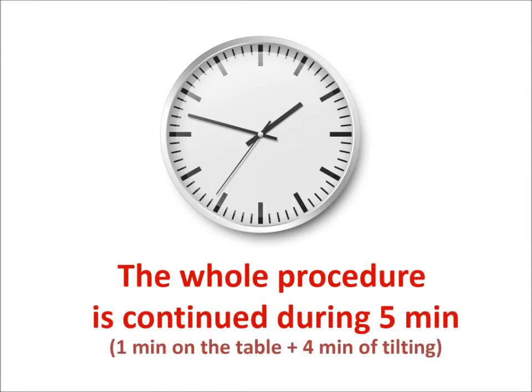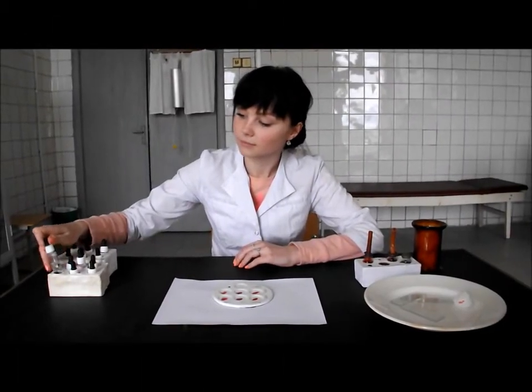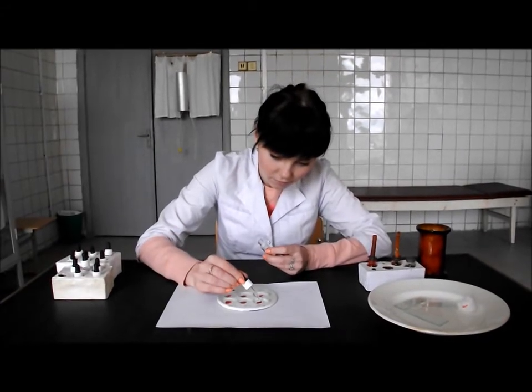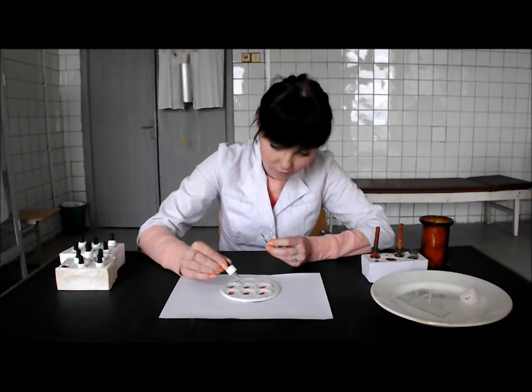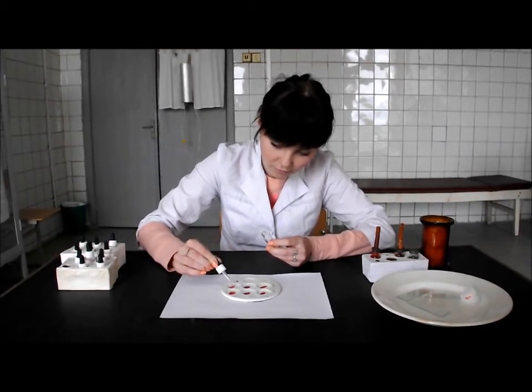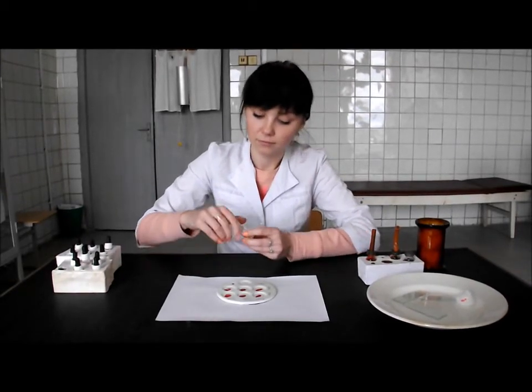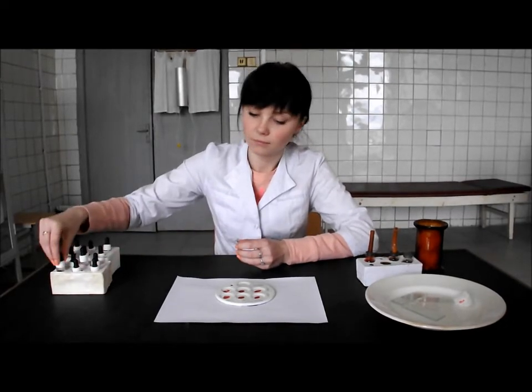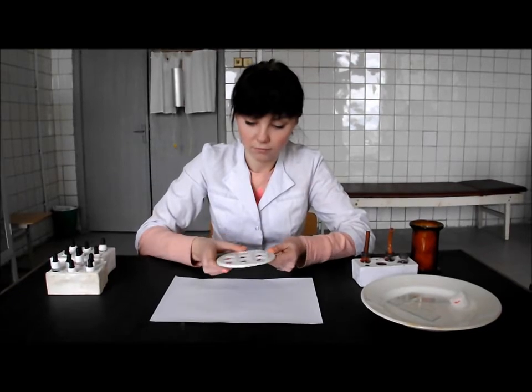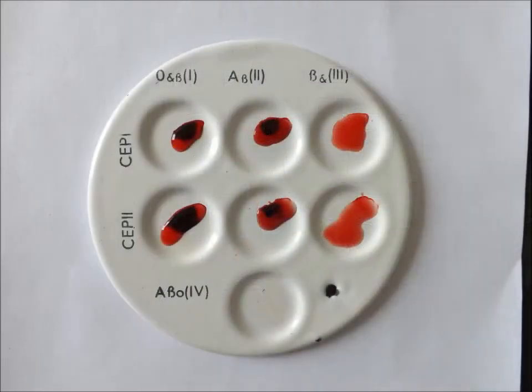The whole procedure is continued during 5 minutes. After that, add a drop of physiological solution of sodium chloride into every blood drop for destruction of false agglutinations. Shake the dish. Estimate the presence or absence of agglutination in each cell.